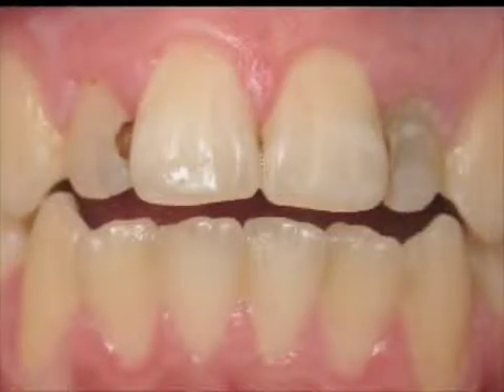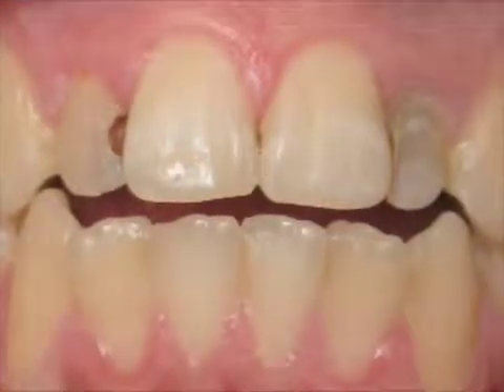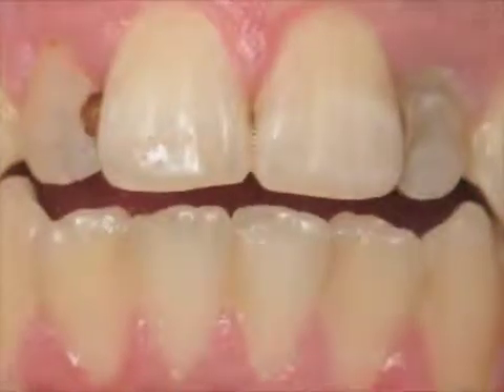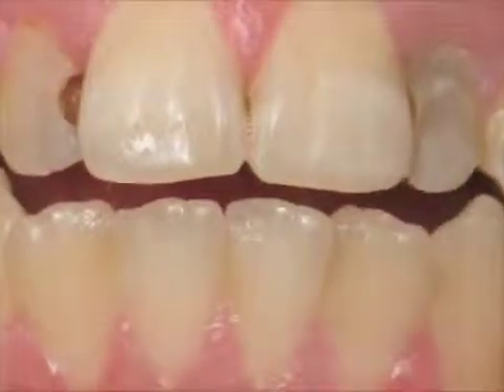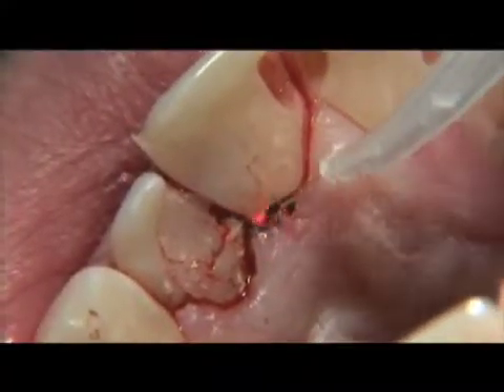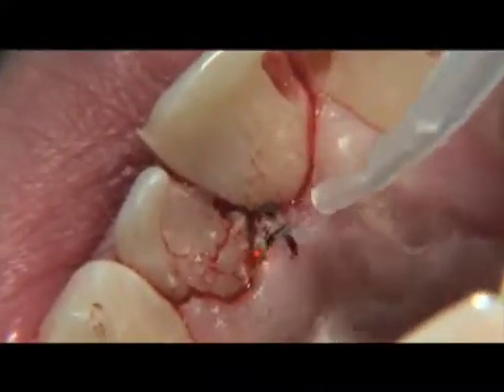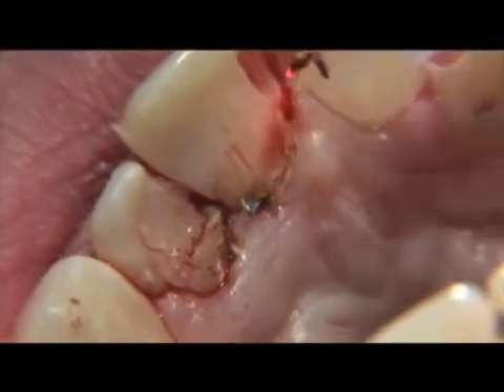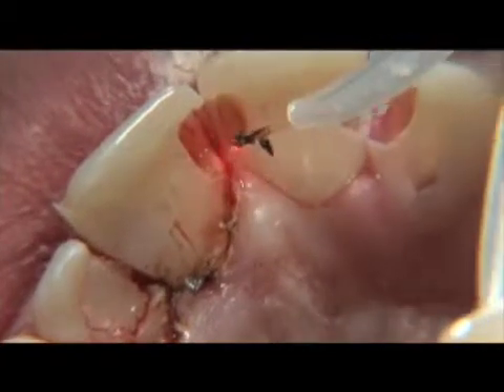This is a 16-year-old male patient with extensive caries and recurrent decay on teeth numbers 7 through 10. Before placing the restorations, we're going to go around the teeth and coagulate the heavy bleeding. To do this procedure, we're going to initiate the tip. We're going to use 1.4 watts of continuous wave energy.